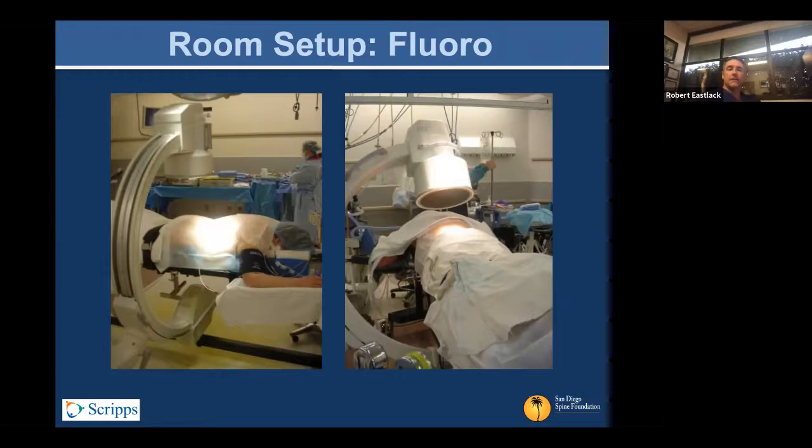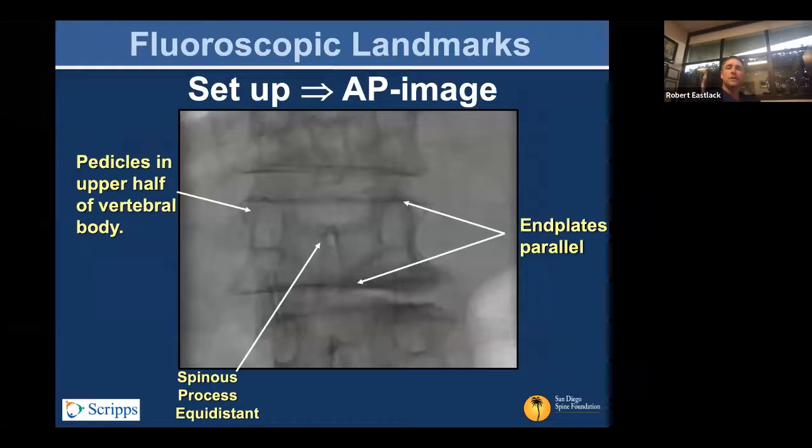The room setup looks something like this. You have the fluoroscopy unit typically starting in the AP position, and you change the Ferguson angle or cant appropriately to optimize the profile view of each segment of the spine. You want a picture in which the pedicles on either side are evenly bisected by the spinous process — the interpedicular distance should be bisected at each level. You want an en face view of the end plates of both the cephalad and caudad ends of the vertebra.